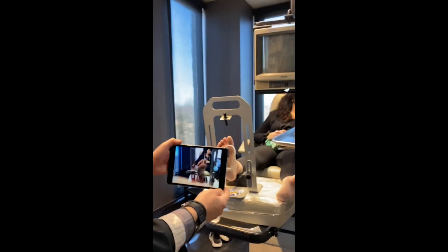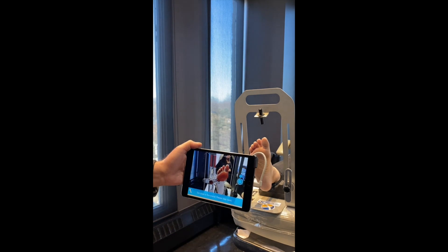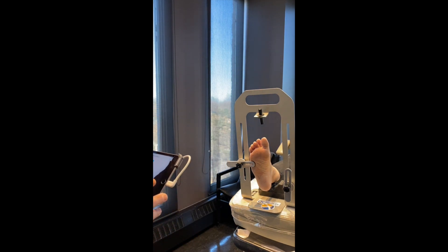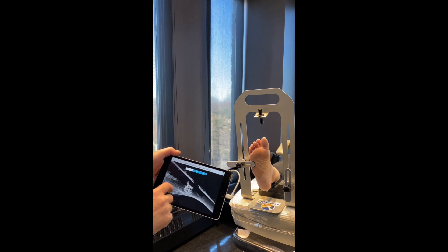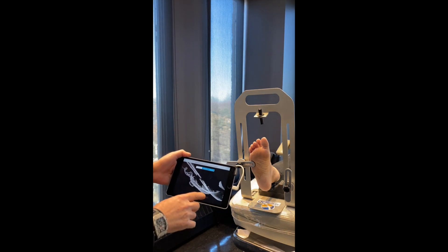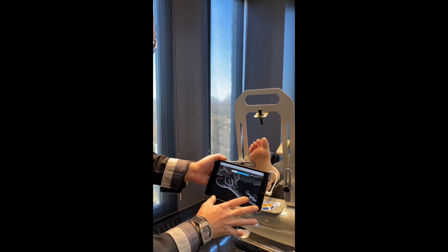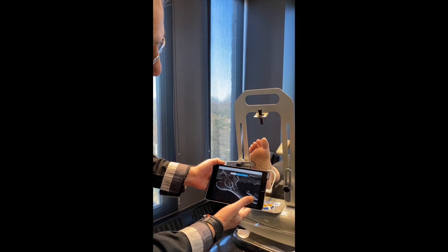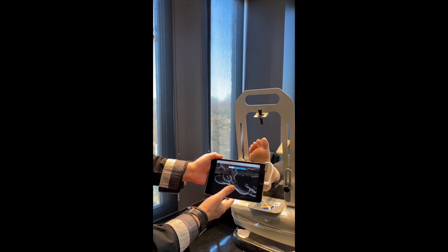We're going to capture the scan. It's quite easy — all you do is input the patient's name and take the scan. Now we can move the scan around any which way we want to check for accuracy. This particular scan actually has to be retaken, but it shows you what it can do — it shows the entire foot in neutral position. Then all we do is press a button and the information is sent electronically to the orthotic laboratory, the prescription is completed, and then we wait for the delivery of the orthotics.